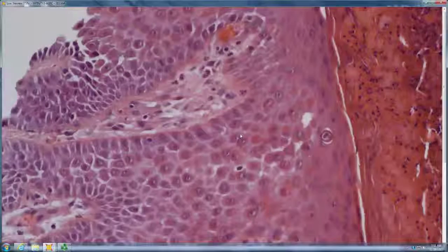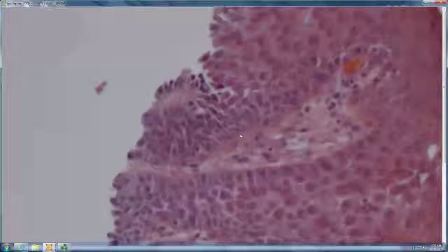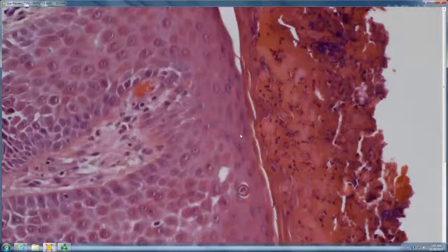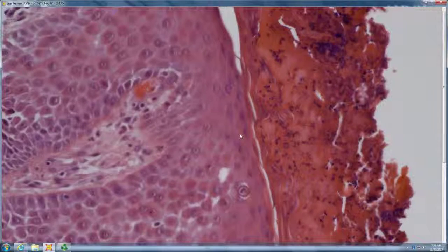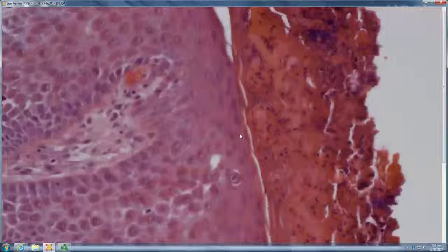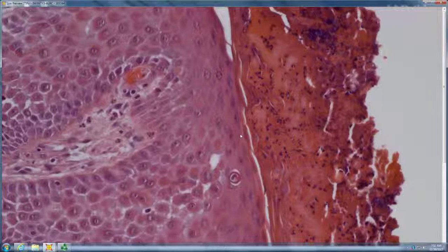I think there's both colors. Maybe there is just one little cell acting out there. The rest of them are red. Clinically, this was Hailey-Hailey. That one cell is the exception that proves the rule. It is very, very rare to see any clear or blue rings in Hailey-Hailey. In fact, this may be the first example where I could take a picture and say, there, you got one clear one right there. Your predominant pattern is they're distinctly red rings around the nuclei. So clinically, that was Hailey-Hailey.